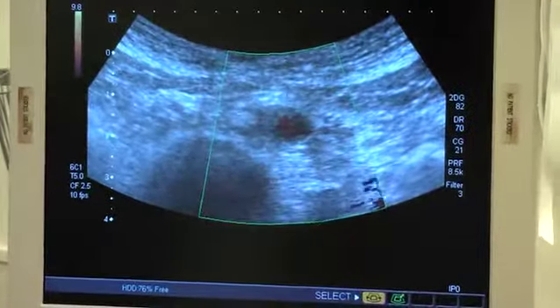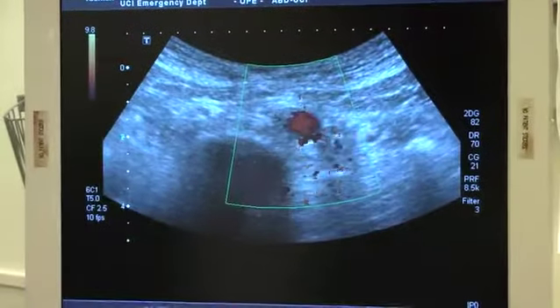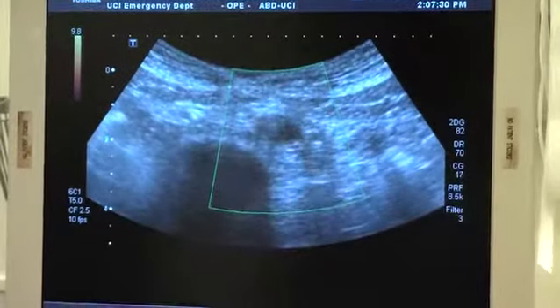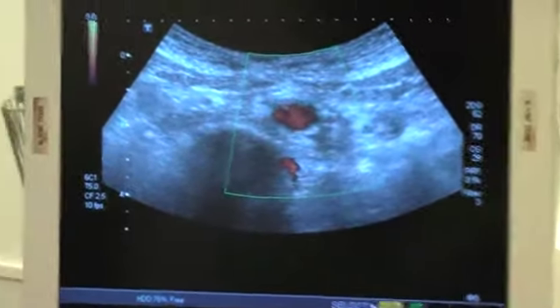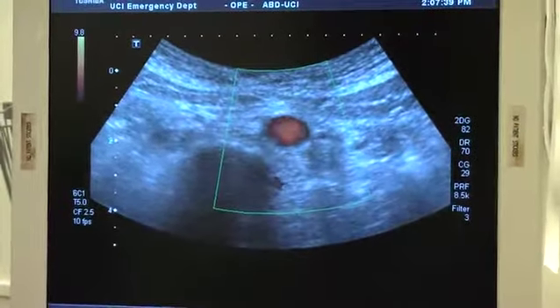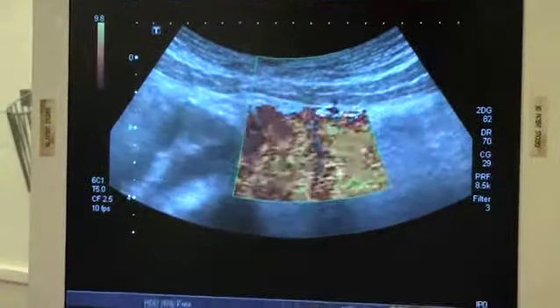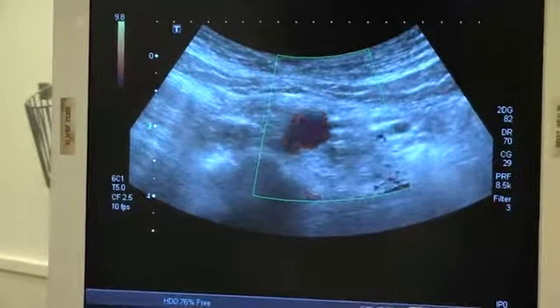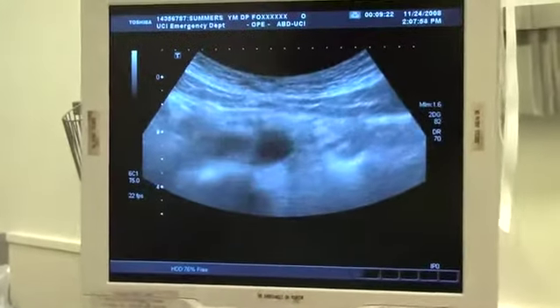And we only use color really for fun. We don't really use it much for diagnostic purposes 98% of the time. The only time I use it diagnostically is if I'm looking at the testicles, or sometimes the ovaries for flow, or sometimes around the appendix when it's inflamed, or an ectopic pregnancy for increased flow or ring of fire. Otherwise, I don't really bother so much with the Doppler. It's cool to look at, it's pretty, and it outlines the vasculature well, but we don't use it diagnostically very much in emergency ultrasound.